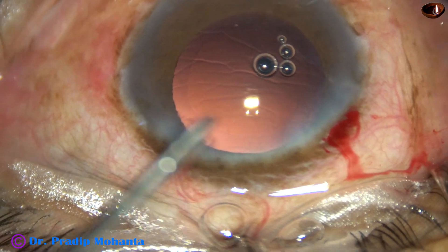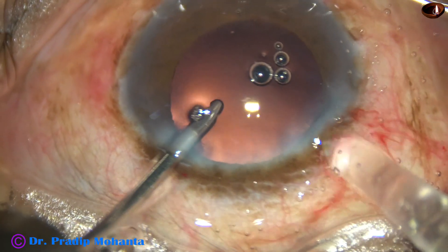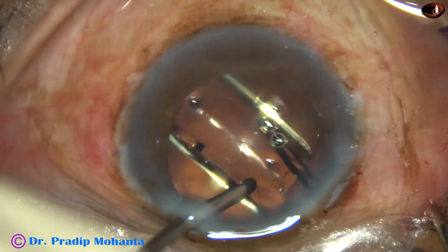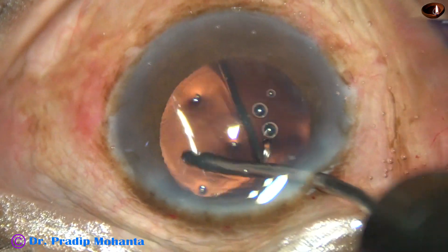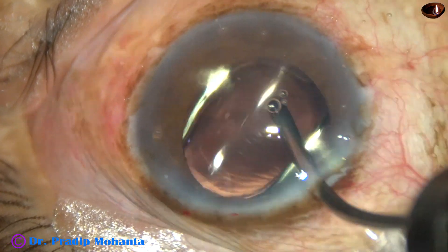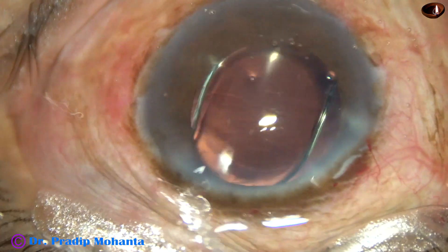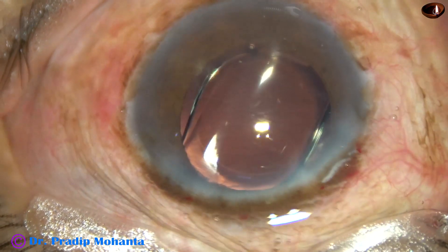This is hydro-implantation of a single-piece monofocal aspheric intraocular lens. This is a beautiful lens, and it is going into the capsular bag. Yes, the lens has gone into the capsular bag. The haptics are placed about three o'clock hours away from the main incision so that I can go behind the IOL and remove any viscoelastic molecules if present.